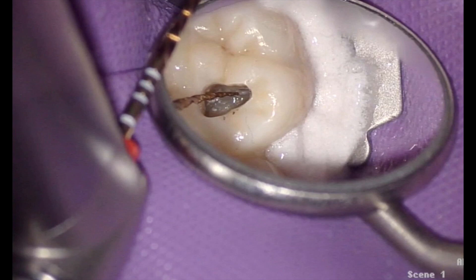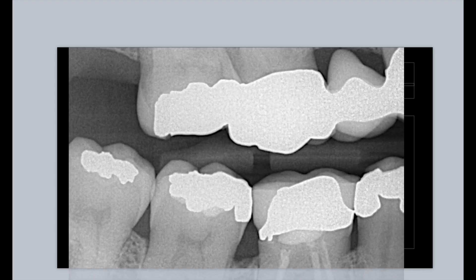I'm watching how deep I'm going. From Rasner, Deutsche Musikant in 2000-something, they talk about the mesial buccal cusp to the roof of the pulp chamber — and that's never going to change. Even with calcifications, it's always going to be roughly six millimeters to the top of the roof of the pulp chamber. So you can use that on any burr if you can measure it out — it's super helpful.